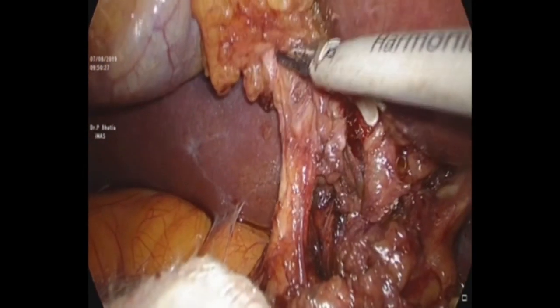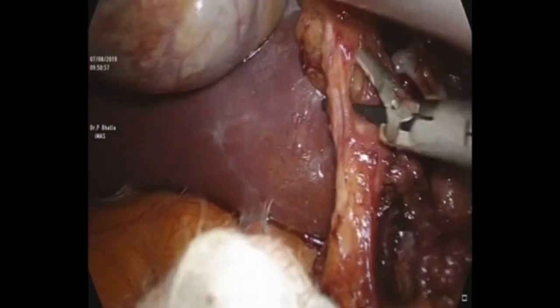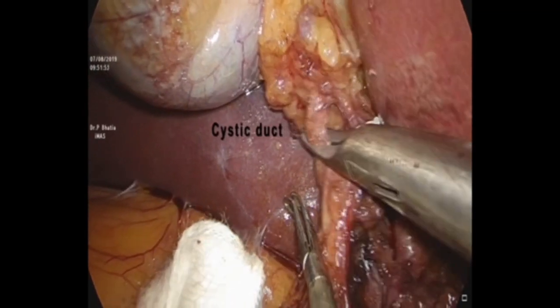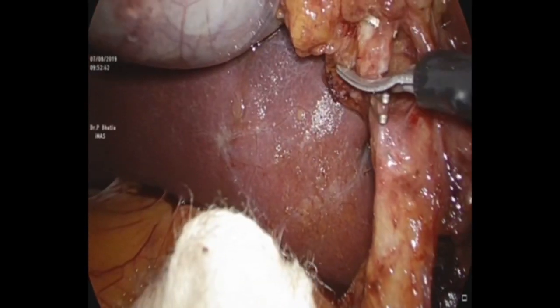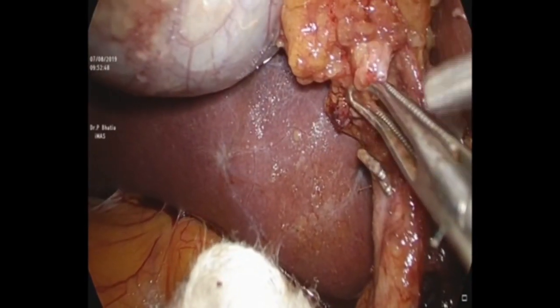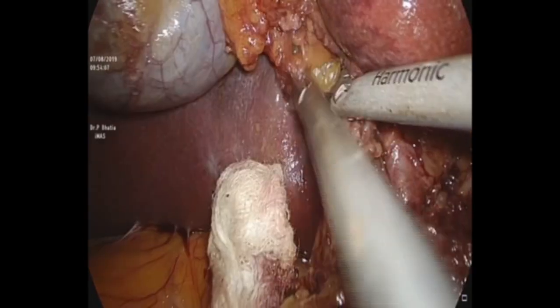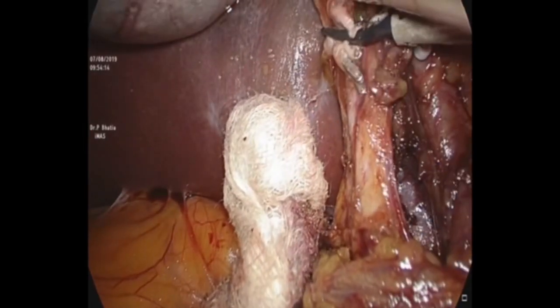Once the cystic artery has been taken care of, the next step is to address the cystic duct. The common hepatic duct is seen and the cystic duct is also clipped close to the common bile duct — two clips towards the CBD side and one clip onto the gallbladder side. The cystic duct margin is taken off and sent for frozen section biopsy. In this patient, it turned out to have no malignancy at the cystic duct margin.